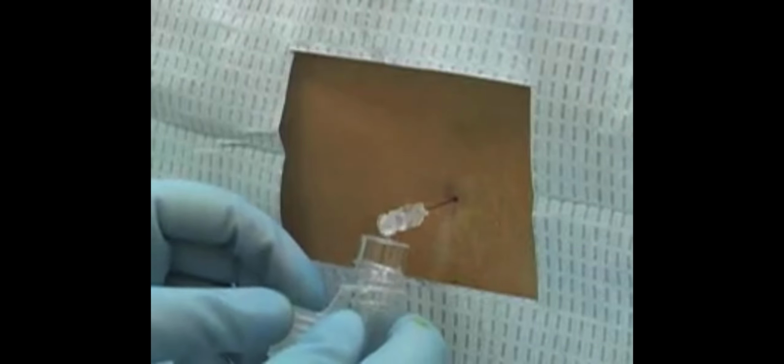You must allow cerebrospinal fluid to drip into the collection tubes. Never aspirate cerebrospinal fluid. Even a small amount of negative pressure can precipitate a hemorrhage. The amount of fluid collected should be limited to the smallest volume necessary for testing. Typically, 3 to 4 milliliters of fluid is sufficient for routine indications.